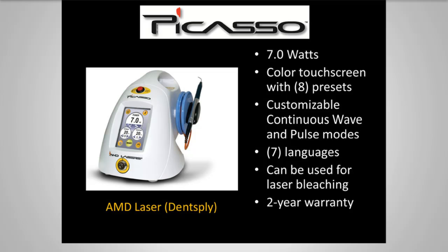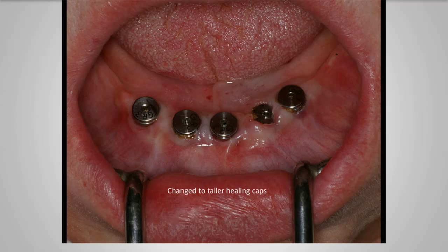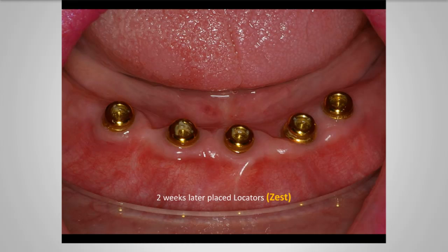The beauty of this laser is it's very cost effective. It has quite a bit of power at 7 watts, and it works very well when you move it from one operatory to another. Once these 2 healing caps were exposed fully, we went ahead and removed all the healing caps and placed new taller healing caps so that when this gingival tissue heals, it would heal completely around these taller healing caps.